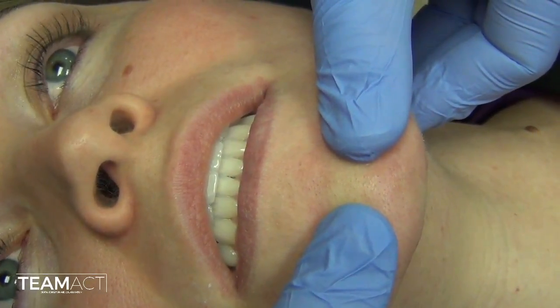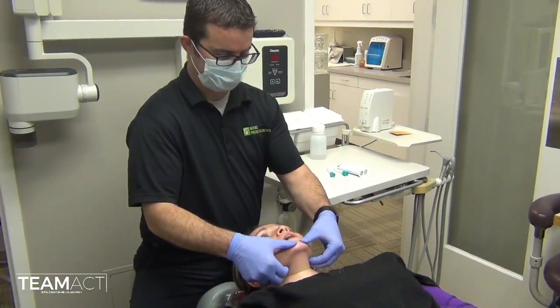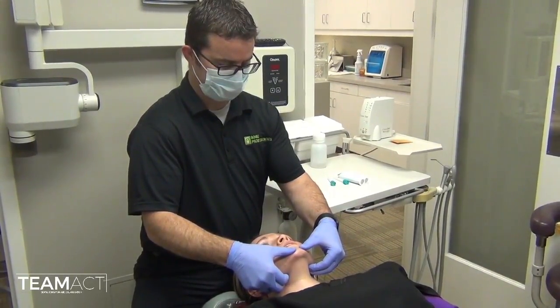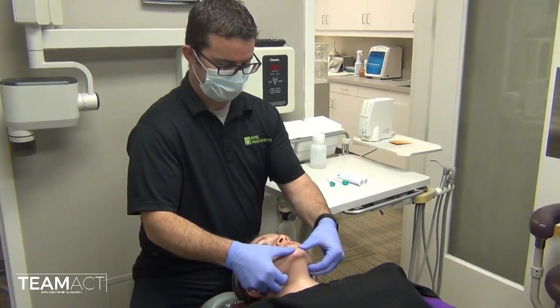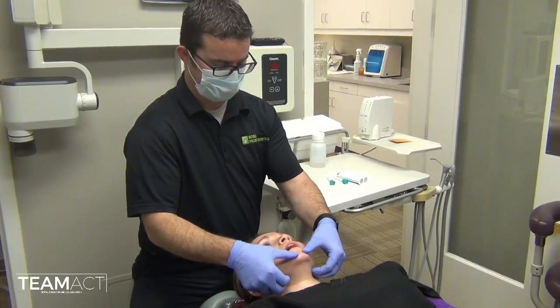As you can see, we have found that position multiple times and now we are ready to record that position with our interocclusal record. Instruct the patient to not close their teeth together while you are getting the supplies and materials ready.